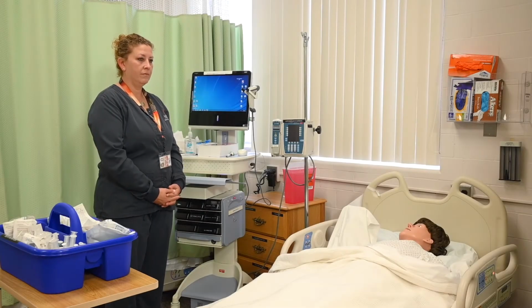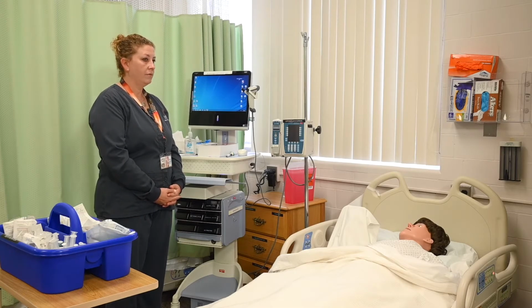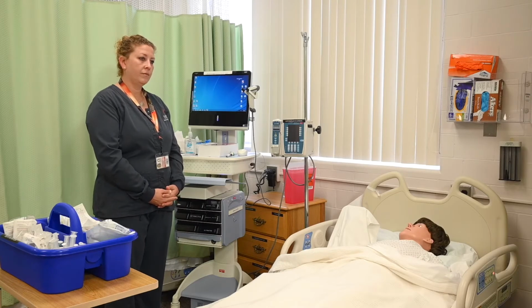Hello, today we are going to be taping NUR Revised 365 IV Insertion and Discontinuation Formal Competency. And today Sarah Enriquez is going to serve as our student nurse.